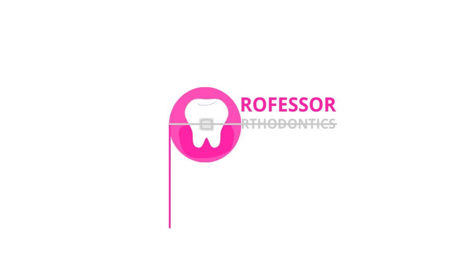Circumferential supracrestal fibrotomy and interproximal stripping together can be used to improve retention and decrease relapse following orthodontic treatment, along with the conventional retention regime. In individuals where the chances of relapse are higher or the relapse can be predicted, these two methods can be used as an adjunct to increase retention along with the retainers for the patient. So, let's start learning interproximal stripping or enamel reduction.